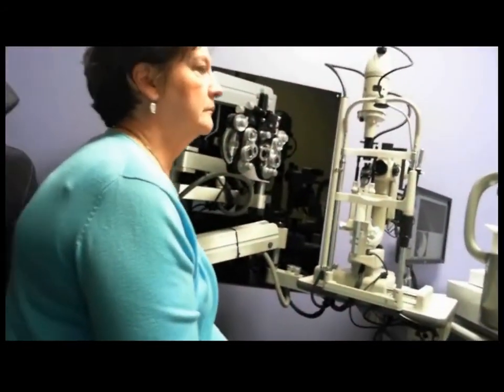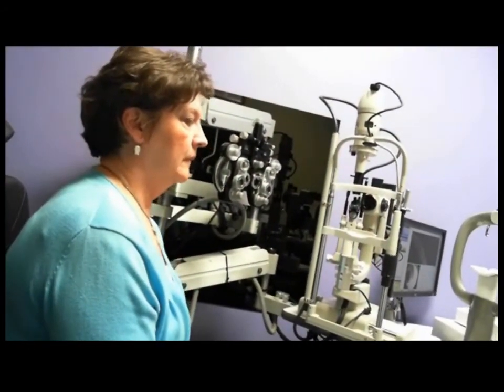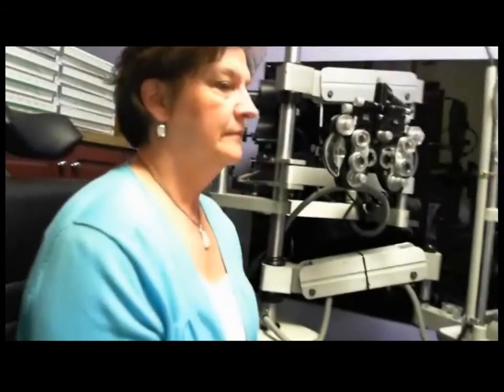So now let's take a look and let's see how we did. We can visually inspect to see if we trapped an air bubble. And so let's get pretty close.